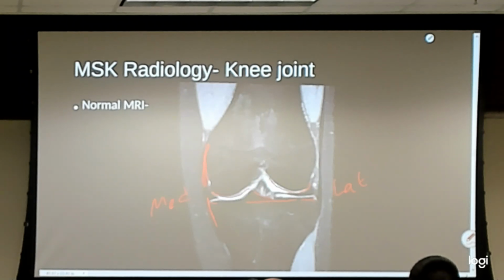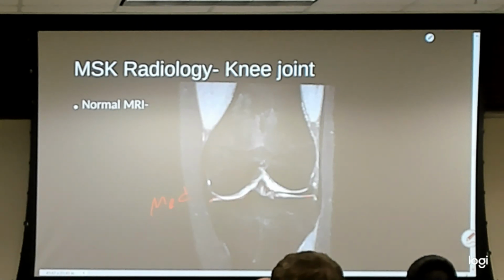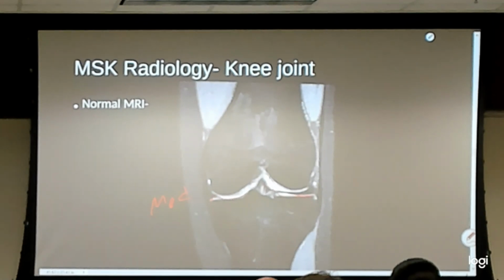Your tibial cartilage is much more obvious than mine. But the tibial cartilage is that same density. So once you found it on the femoral side, the tibial side, again, gray outline. Caught a little of the, right there. Okay. Being the cartilage. So what's the stuff in the middle?